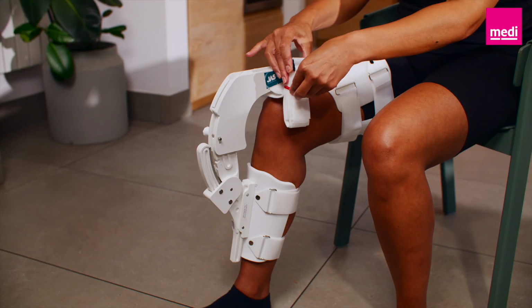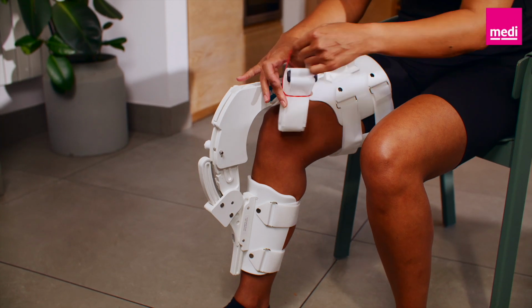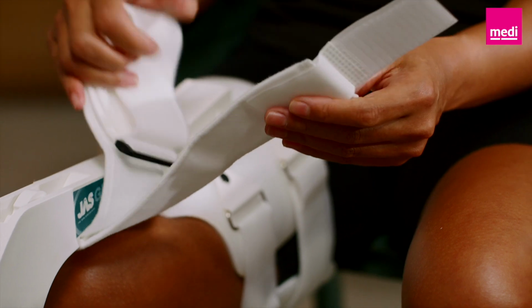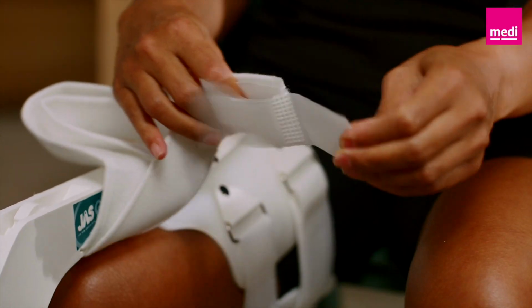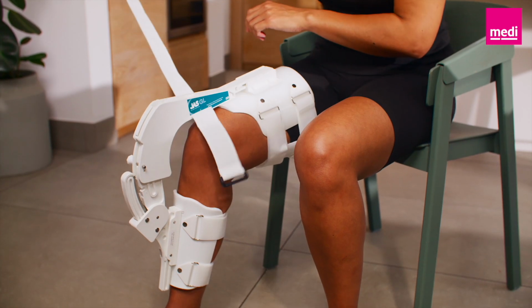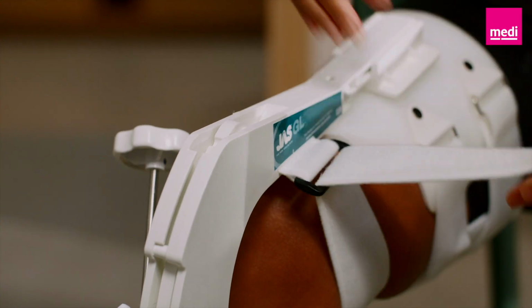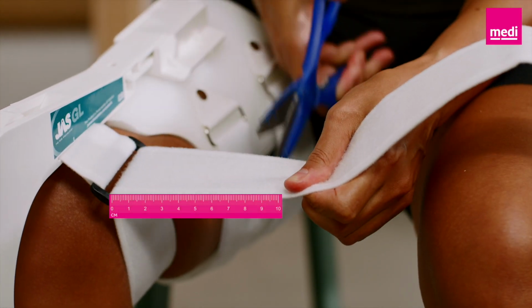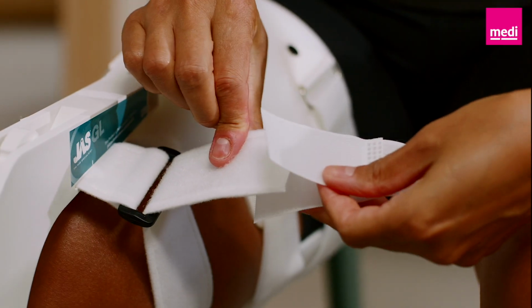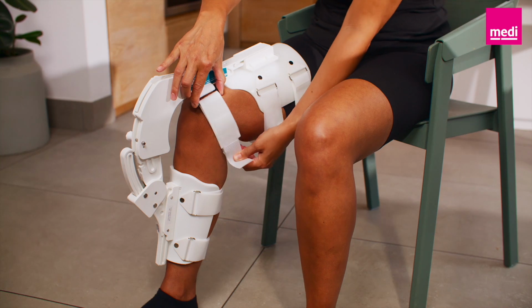The knee strap offers extra support to keep the thigh cuff in place. You'll need to trim this down to your size before the first use. To do this, follow these steps. Release the strap and remove the hook and loop attachment at the end. Thread the strap through the D-ring for a snug fit around your leg and hold it in place. Measure about 10 centimeters of strap from the D-ring and trim off the excess. Reattach the hook and loop, then fasten the strap securely on your leg.